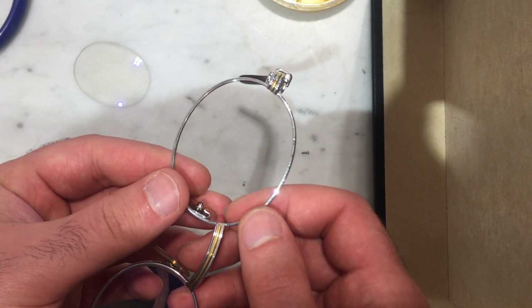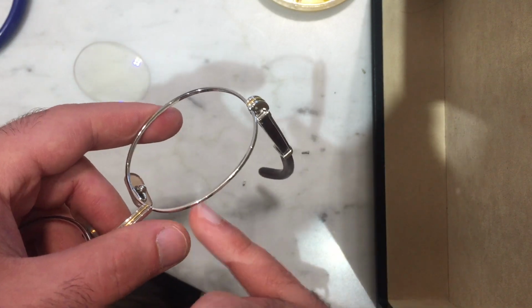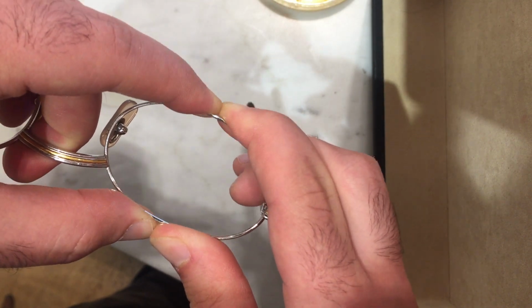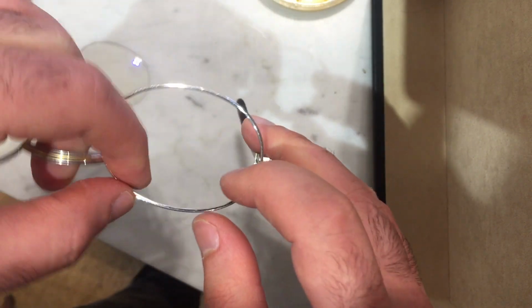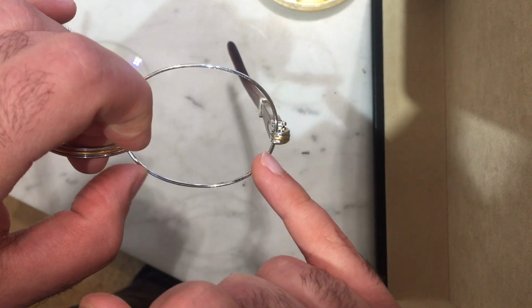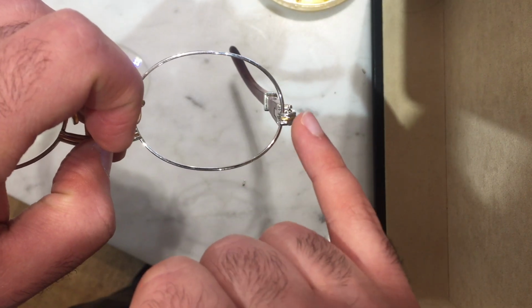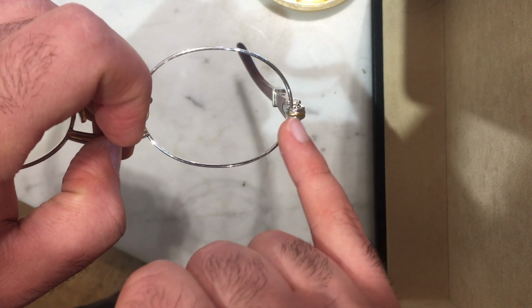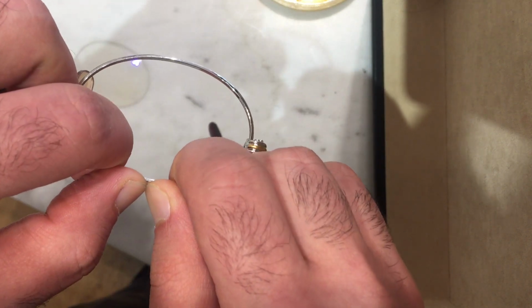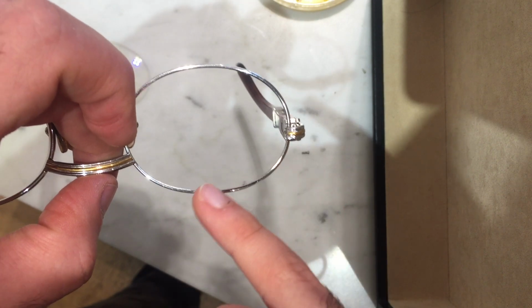Now, you basically have to bend the frame, and especially if it's slipping out of the top and the bottom, just give it a little squeeze in that direction. Or if you're not doing it like that, hold it like this and just give the top a little bit of, you're going to attempt to, on a very small scale, make this little curve a little bit more, in exaggerated terms, like this. So bring this in a little bit to make it a little bit flatter on top, and you can kind of see the difference already, and that'll make it tighter there.